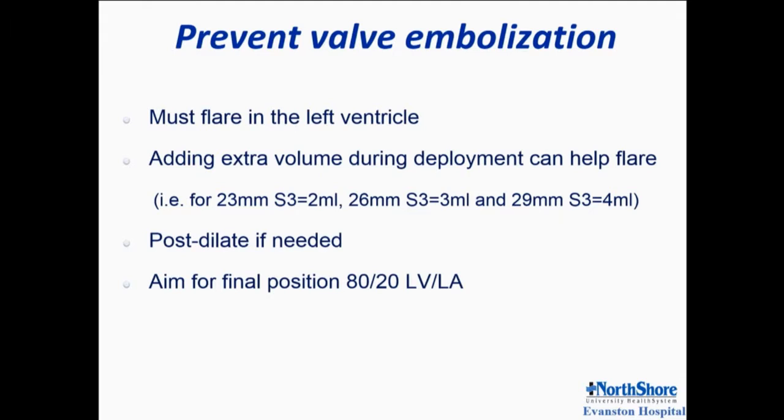We prepared these devices with extra volume. Before, we were deploying a nominal and then post-dilating. We realized you had to flare, so what's the point in doing two inflations? Just add the extra volume and then deploy. So you do two in one. That saves you one pacing run, and you can use that for later further post-dilatation if that's needed.